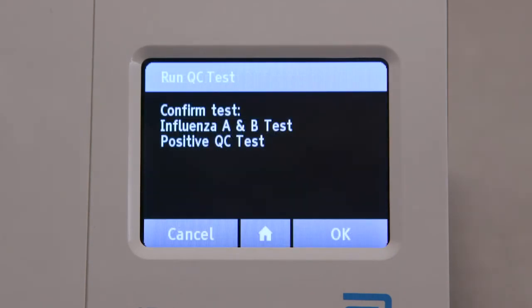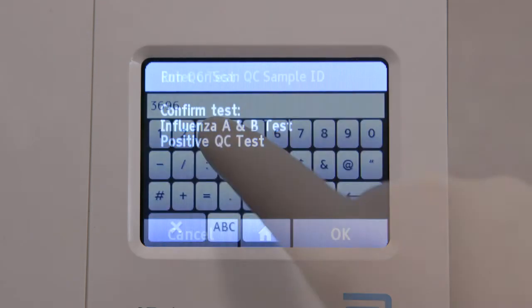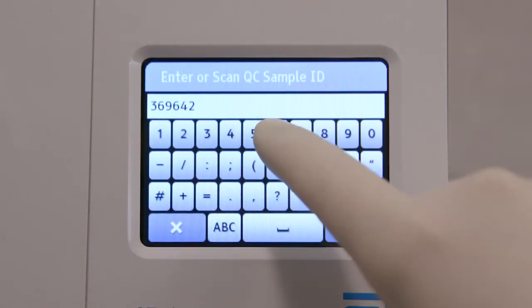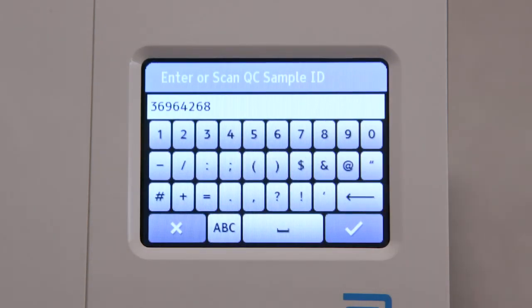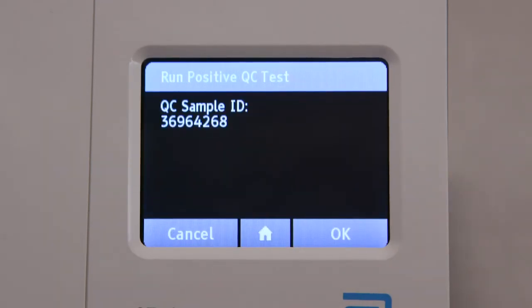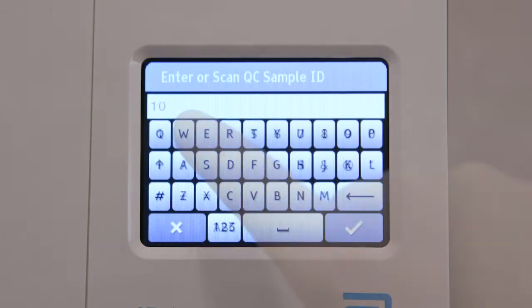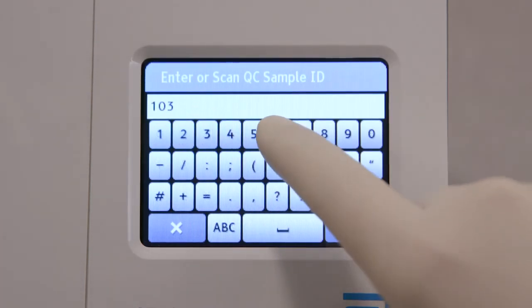If an incorrect QC test has been selected, press Cancel to return to the QC test menu screen. Enter or scan the QC sample ID, then press Check to confirm. You'll see the QC sample ID displayed. Press OK to confirm, or press Cancel to return to the QC test menu to re-enter the correct sample ID.